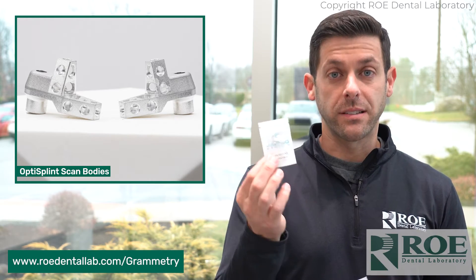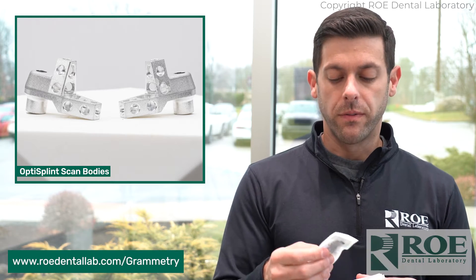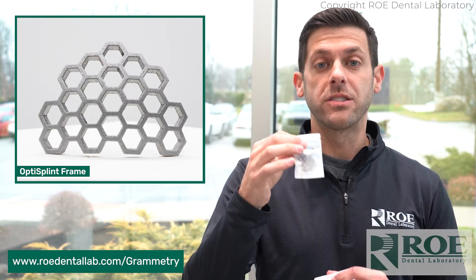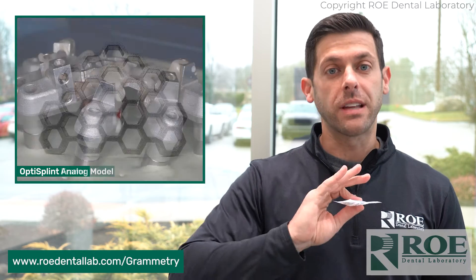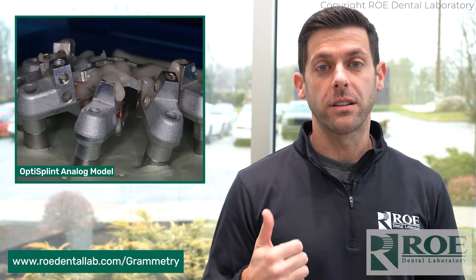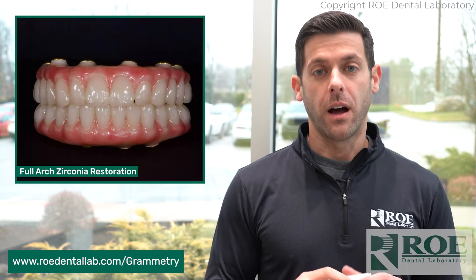So, scan bodies — we have six of them in here, and they all are connected via this little framework. It's a metal frame. The nice thing is, once you loop these together, it's not going to move, and we can make an accurate model from this OptiSplint. You just send us the OptiSplint, and we are going to make a nice model and create a great-fitting, passive zirconia to this model.